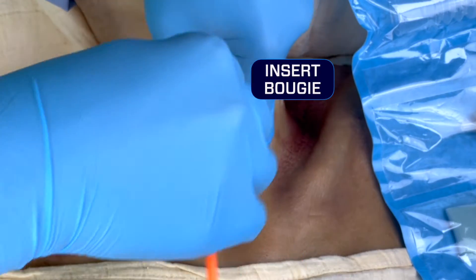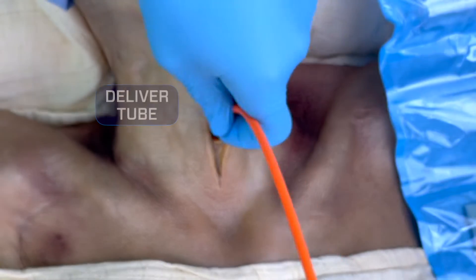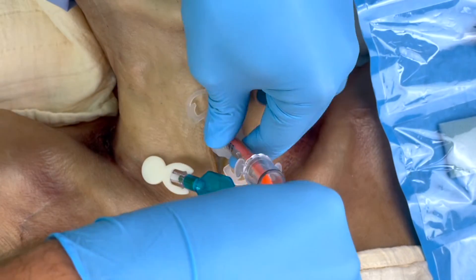Now go ahead and take the bougie and slide it past your finger into the trachea. Then take the tube and slide it over the bougie and railroad it into place.